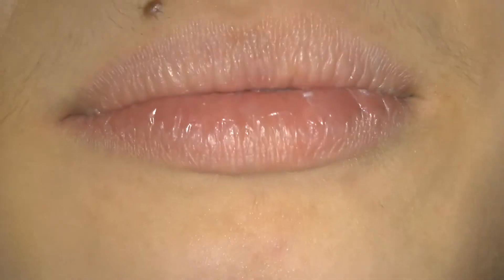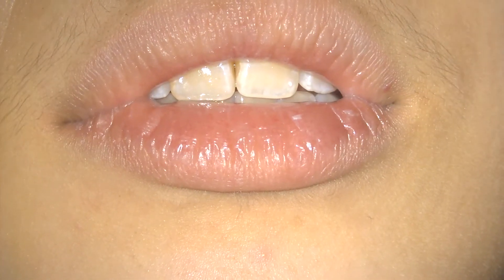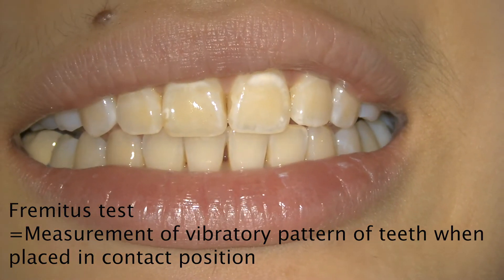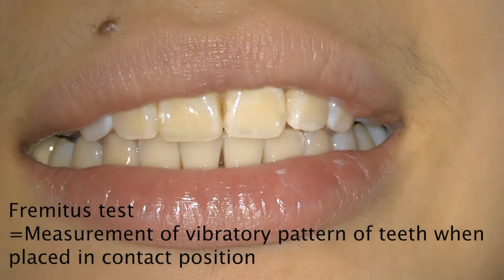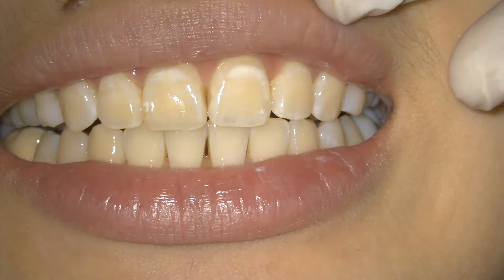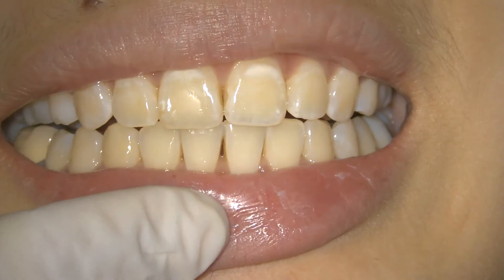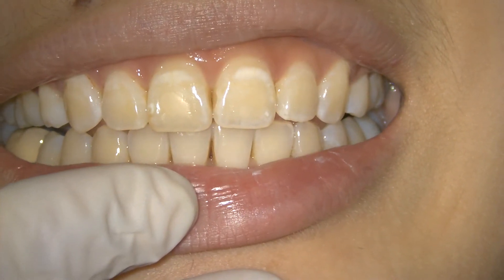We are going to show you how to assess the fremitus test. The fremitus test is a measurement of the vibratory pattern of the teeth when placed in the contact position. It is a very early manifestation of trauma from occlusion. In patients where you feel that occlusal force is a contributing factor for your periodontal disease, you should assess the fremitus test.